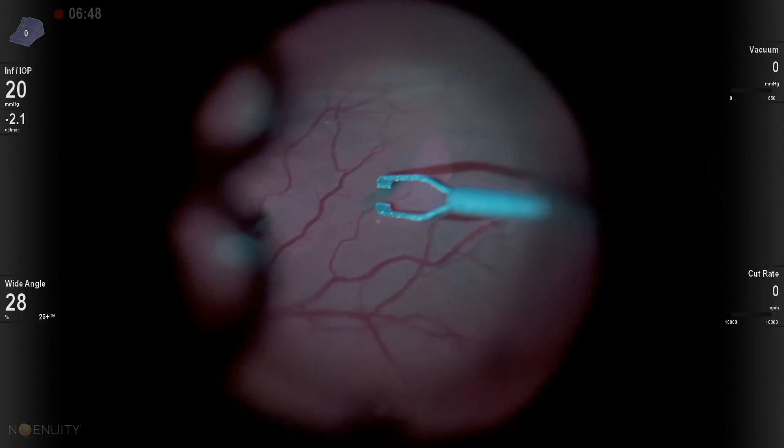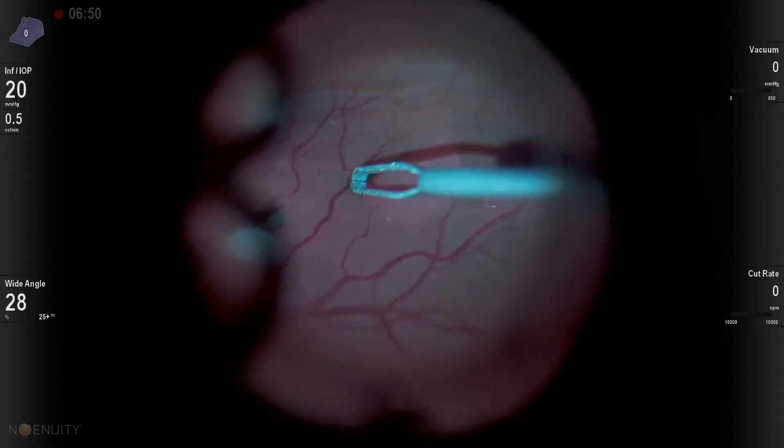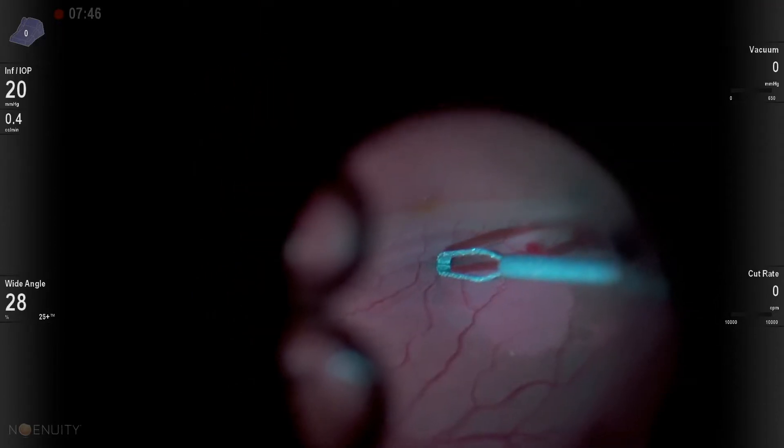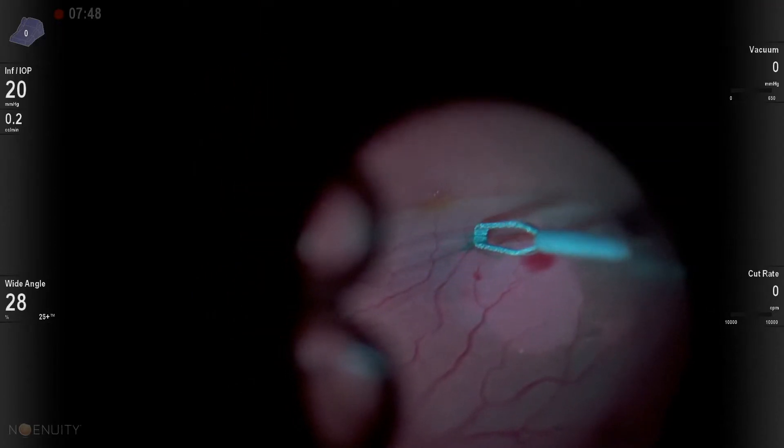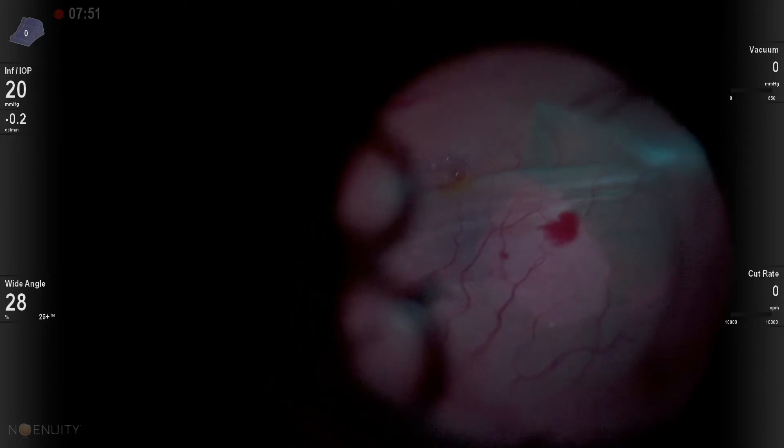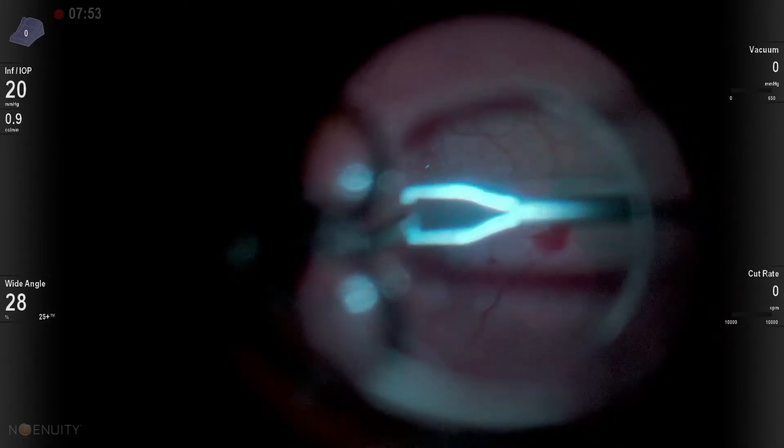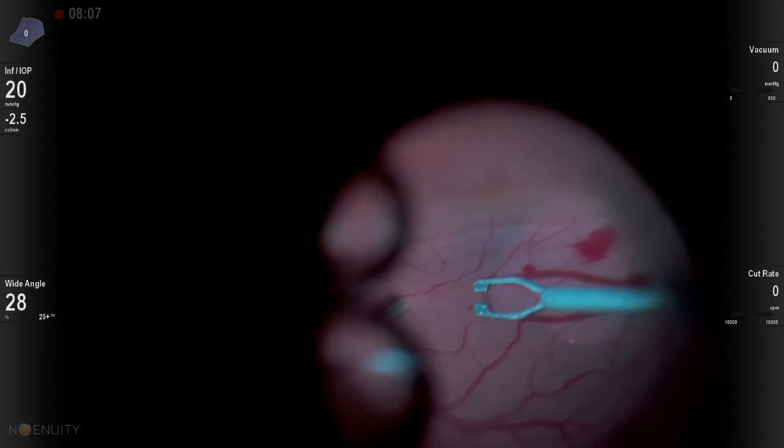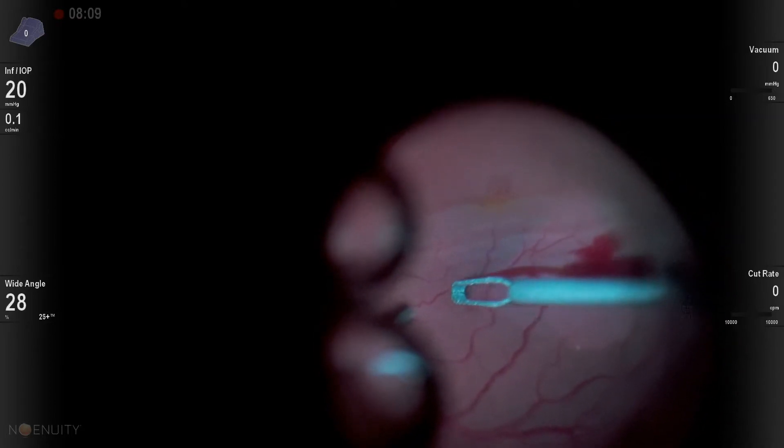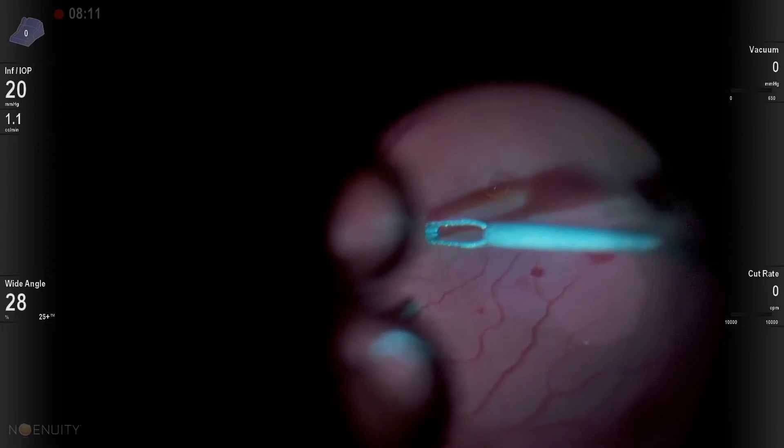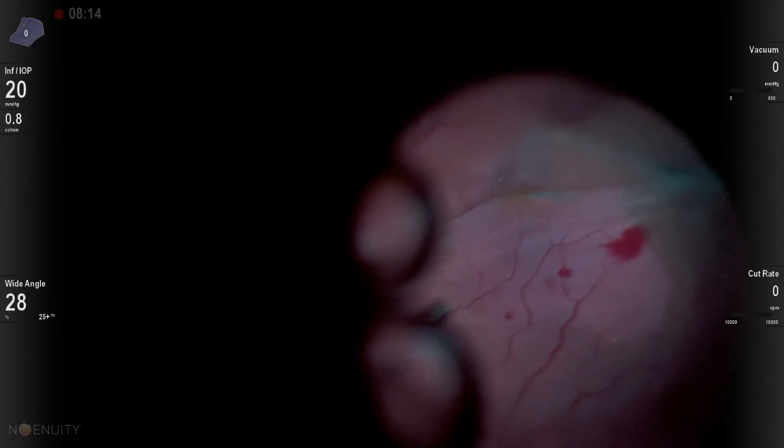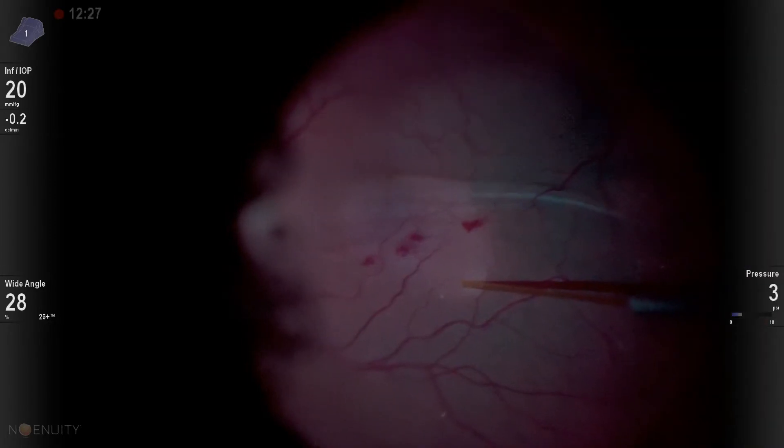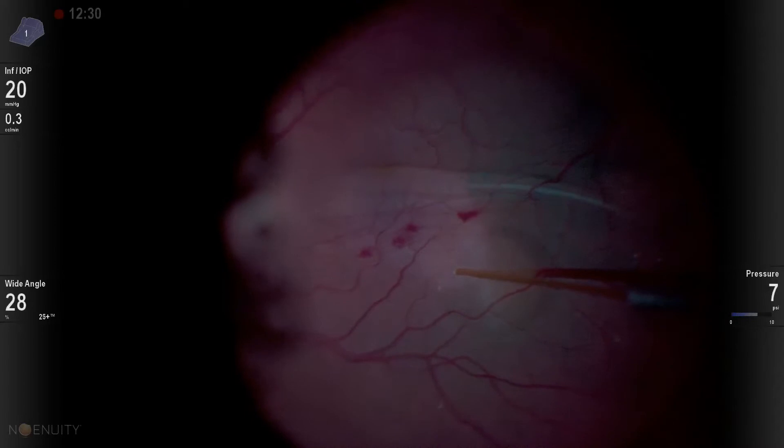So I've only had a handful of macular folds in my career, thankfully, but this is the worst. And I always start out on these macular fold cases by peeling the internal limiting membrane, and I just feel like this provides better access into the subretinal space when injecting subretinal fluid with a 39-gauge cannula, and it also, I think, at least precludes there from being an epiretinal membrane present that could cause the fold to persist.